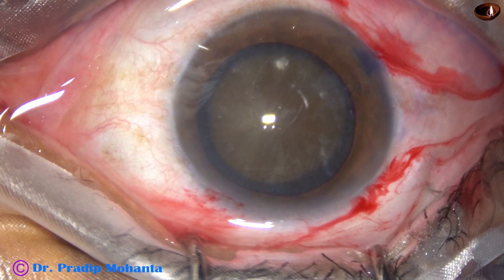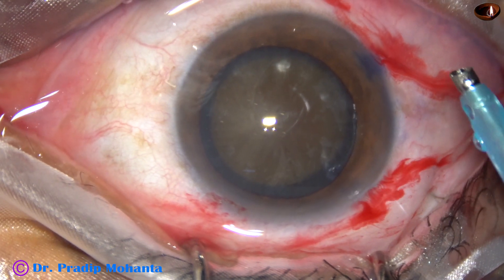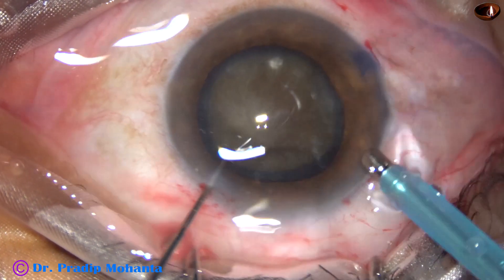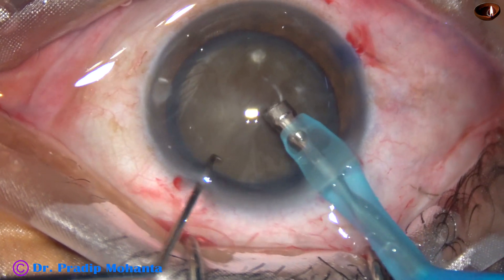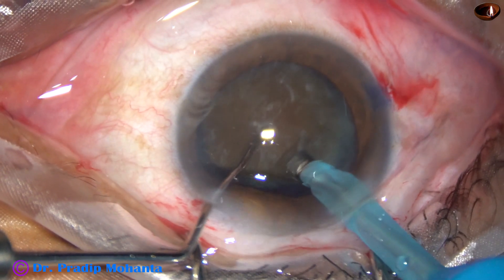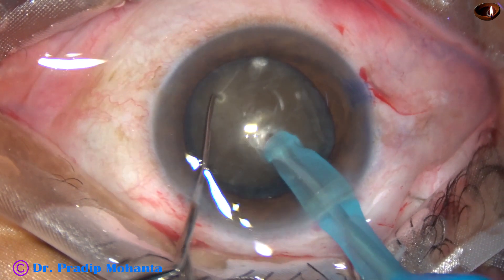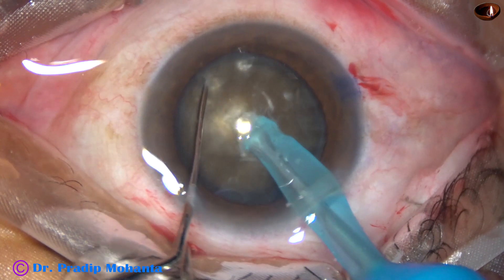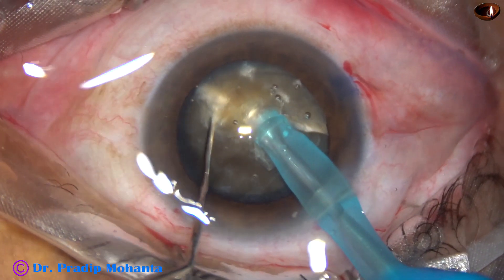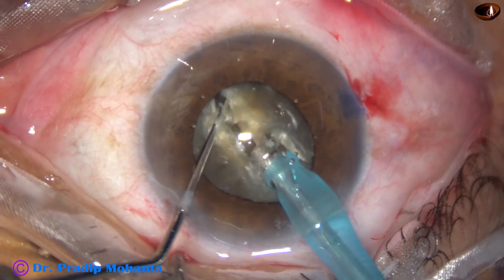The tip of the FACO handpiece is going to be introduced. In this case, I have exposed the tip a little more because the cataract is very hard. I want to use my technique, which I call submarine chop. The tip goes into the substance of the nucleus, goes through the nucleus. The chopper supports the anterior surface so that the lens is not tilted. And here it is — chopped into two large parts.